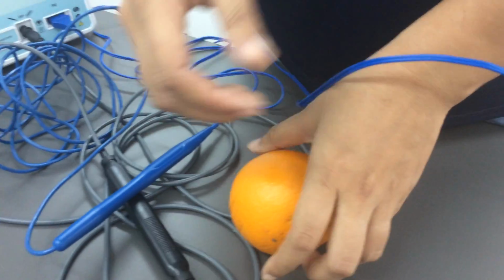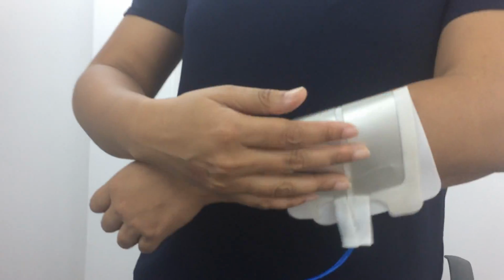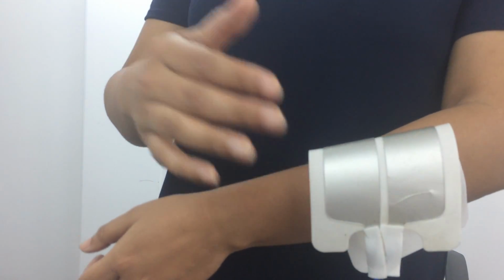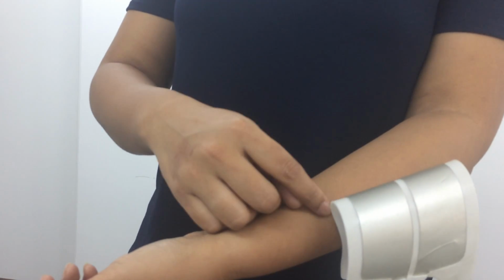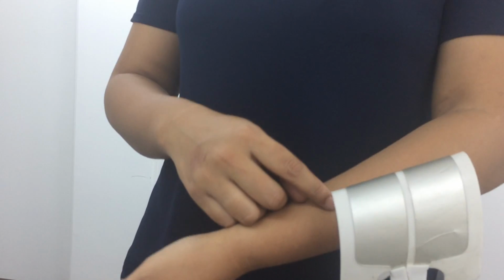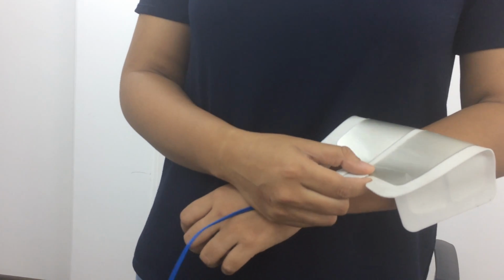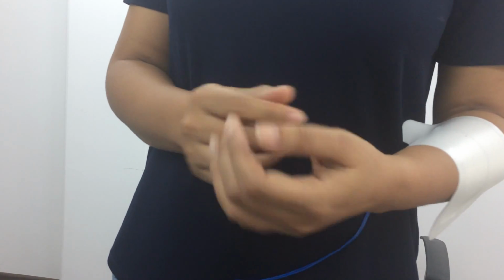So this is a safety mechanism: when the pad is not connected appropriately to the patient body, that is, your pad to patient interface is not adequate and there are chances of patient burn due to high concentration of current at the patient plate site, the machine will automatically stop the power delivery. This is a safety feature that we have in both our Elektriz as well as the Strom.